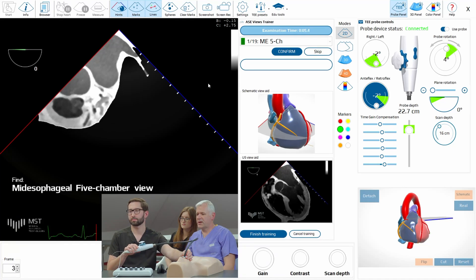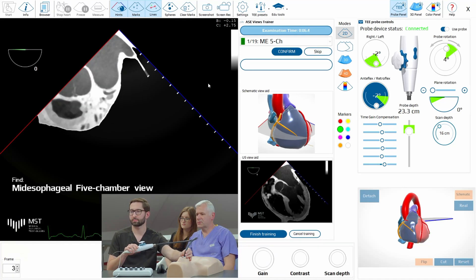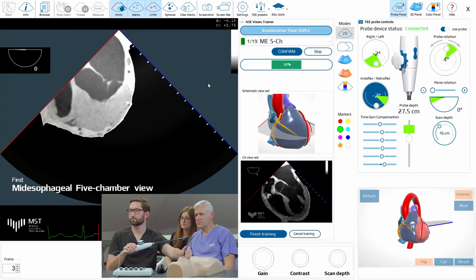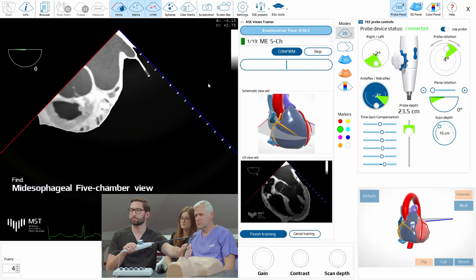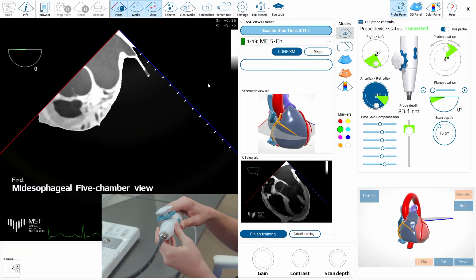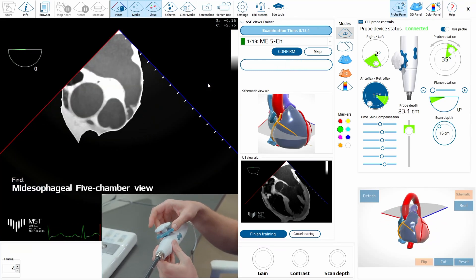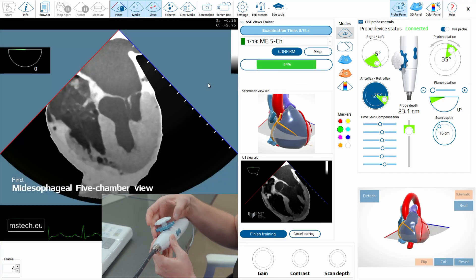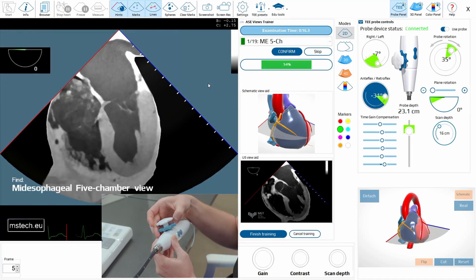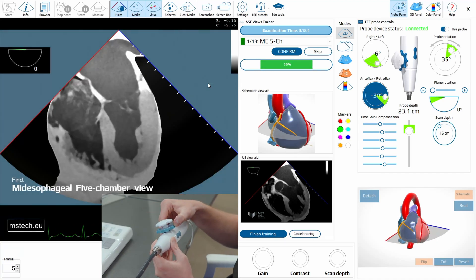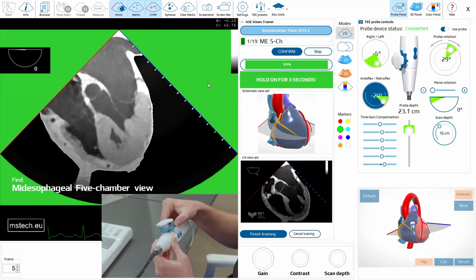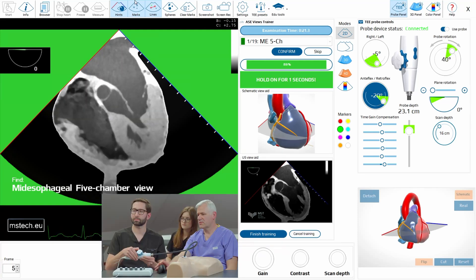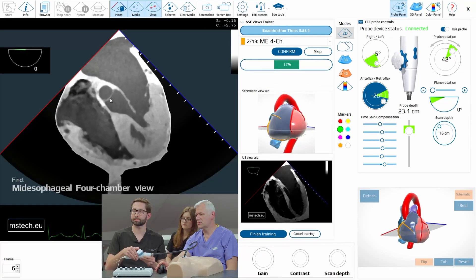You have the five-chamber view to obtain. You are almost there. Aortic valve must be visible in this view.